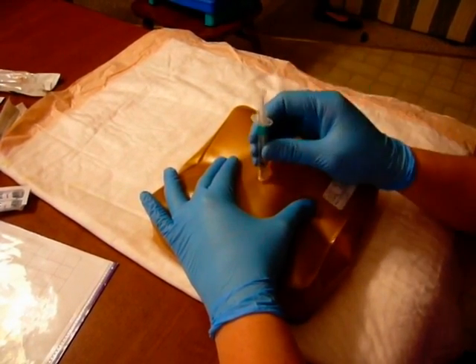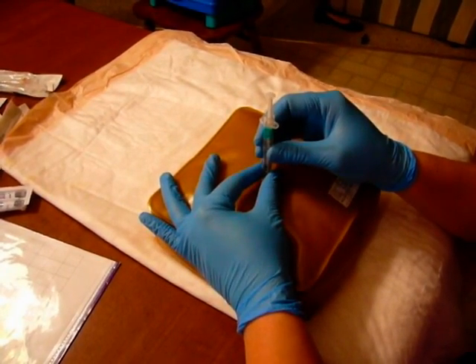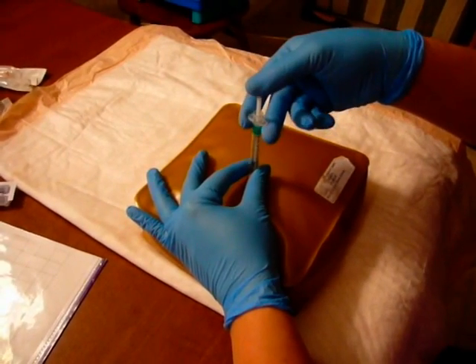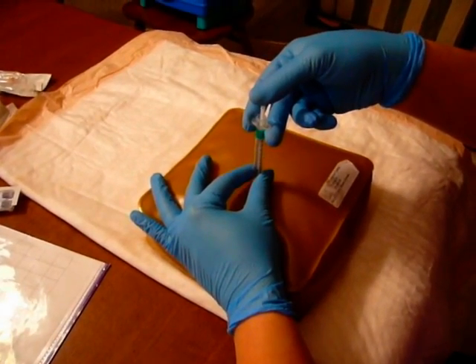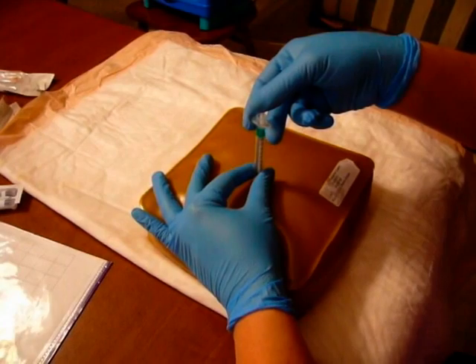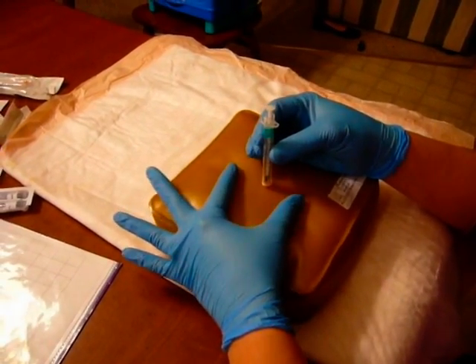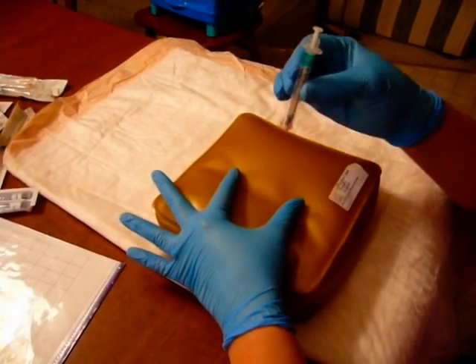I'm going to insert the needle in and stabilize the syringe with my thumb and forefinger. I'm going to inject — you can use either your finger or your thumb. Inject slowly over three to five seconds. Once the medication is completely in, I stabilize again with my dominant hand, bring my thumb and forefinger out, and remove the needle.